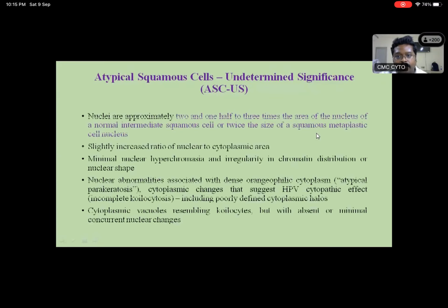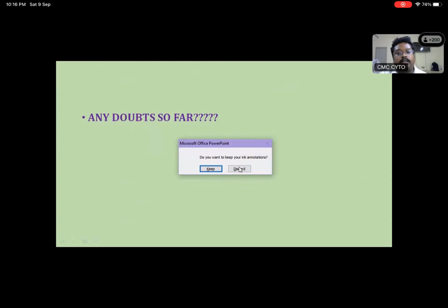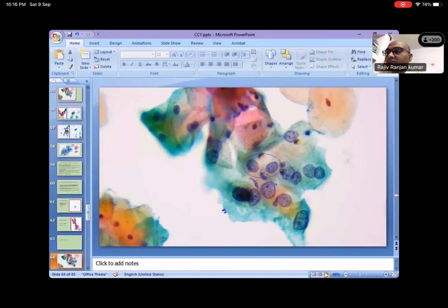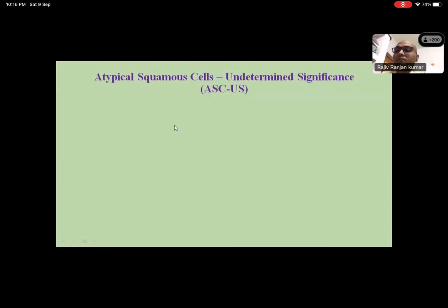The images are not set. Okay. Dr. Vinod, we are coming back to the same image which we already discussed.